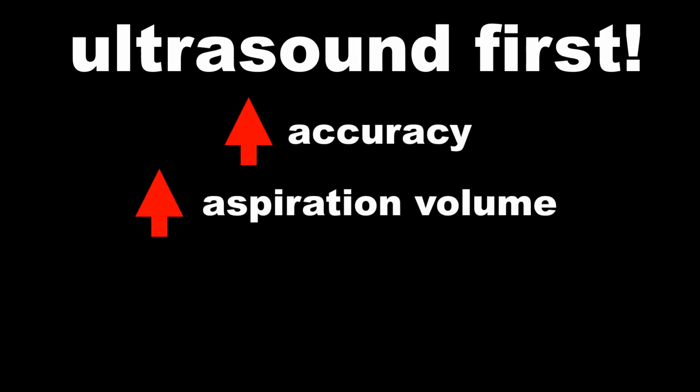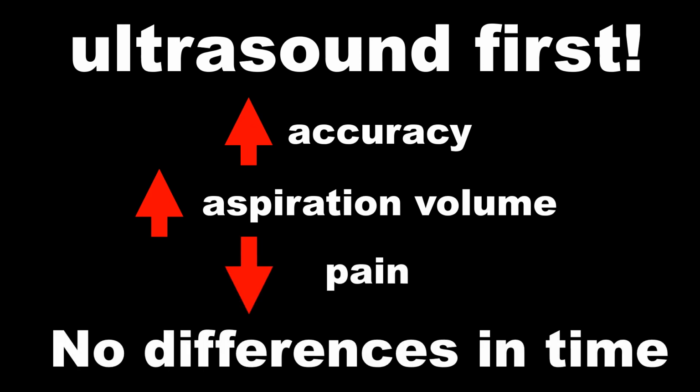There have been a lot of studies looking at this, showing that using ultrasound increases accuracy. It actually increases aspiration volume. It decreases pain for the patient, and it really doesn't take any difference in time.